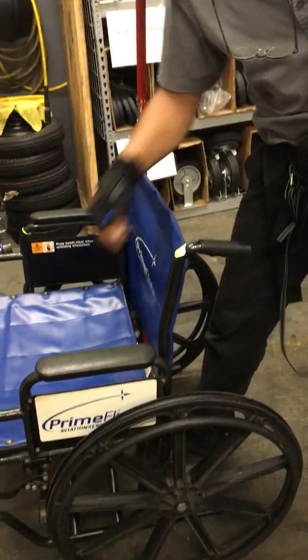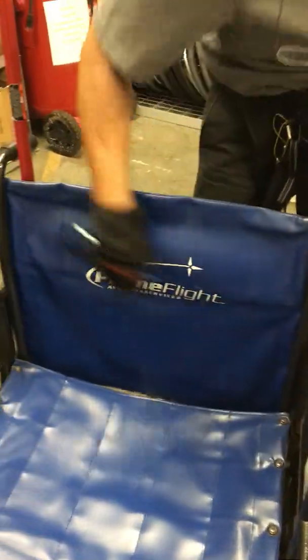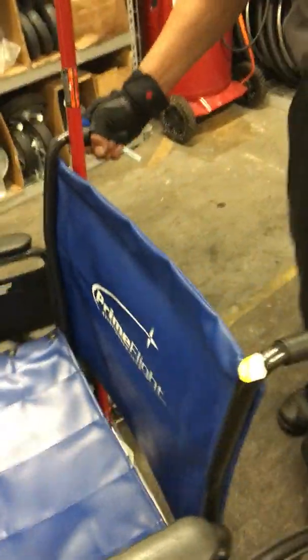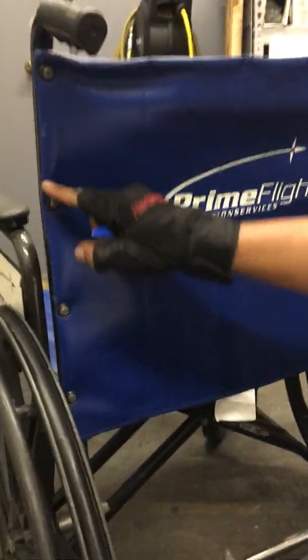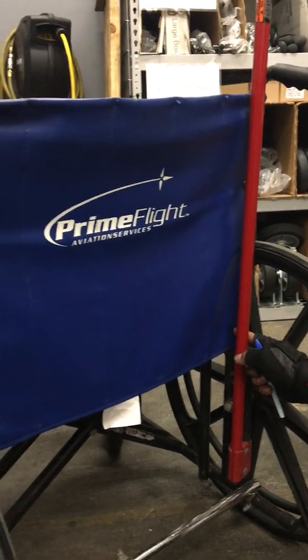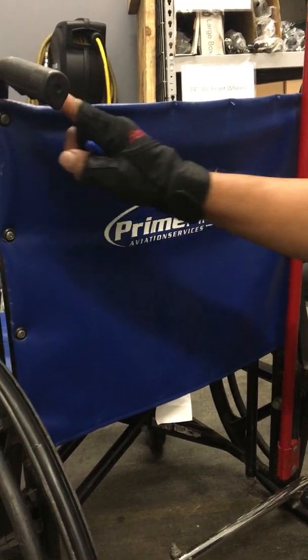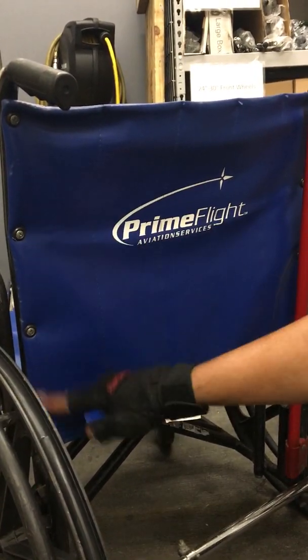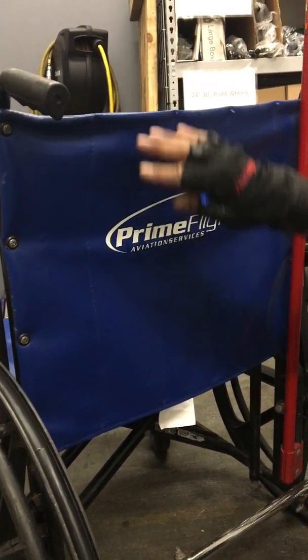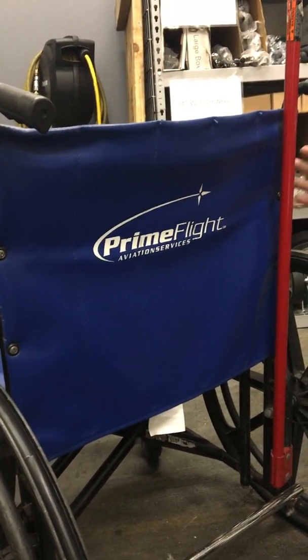Next, I would look at the back cushion. No tears at all. And if there's tears and need to be changed, these are the Phillips screws that need to be changed. And normally it takes about 30 minutes if it's all lined up, the holes. However, if it doesn't line up, it's between 30 to 45 minutes.